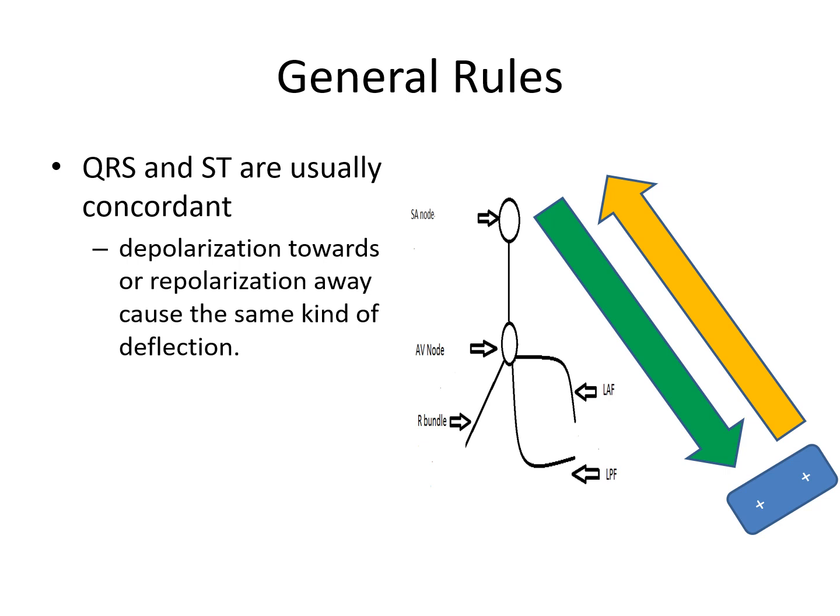So in general, the QRS and the ST segments are concordant, which means they point in the same direction. So what's happening here is if you have a functioning conductive system, it doesn't take very long for the entire ventricle to depolarize, more or less instantaneously or quite quickly. So it comes to the bottom and just kind of reverses itself and repolarizes in the opposite direction. So you have the two processes occurring in the opposite directions, and they're of the opposite electrical sign. So these two negatives cancel each other out, and they produce deflections that point in the same direction on the EKG leads.